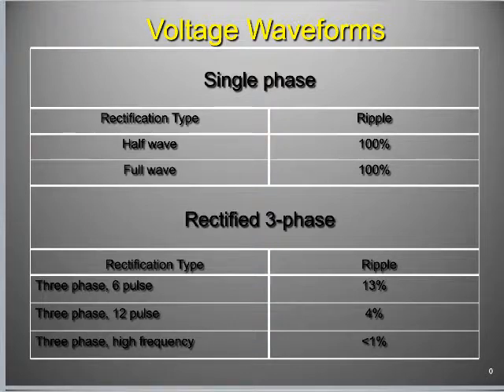We do not want these waveforms. They were there, they helped, we were able to make the power, and we were able to spin the anode with the waveforms. But once we get to the moment of magic, where the guy steps out onto the pool, no waves. We don't want no waves. Don't give me no waves, right? To get rid of the waves, we have to apply rectification, right? So remember I talked about that weird diamond on the high voltage side? That's where the diamond comes in.